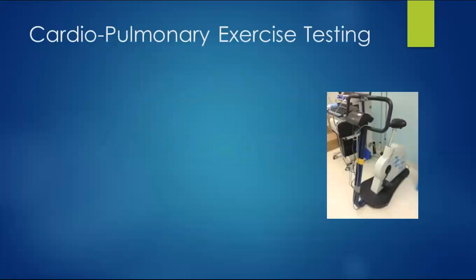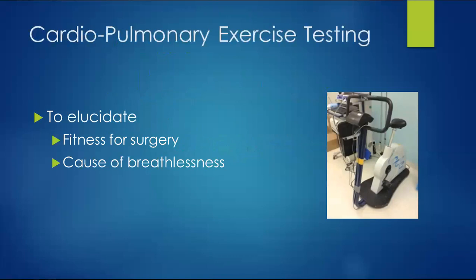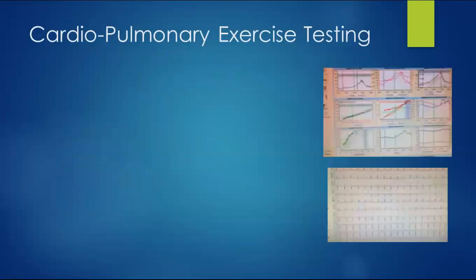The aim is to elucidate fitness for surgery. It's a good dynamic test for cardiopulmonary fitness. It's also used to elucidate the cause of breathlessness, whether it's cardiac or respiratory, as well as allowing us to classify disease severity.